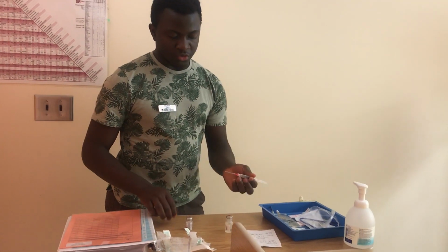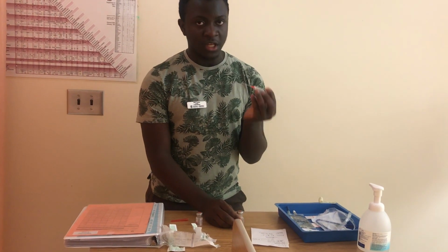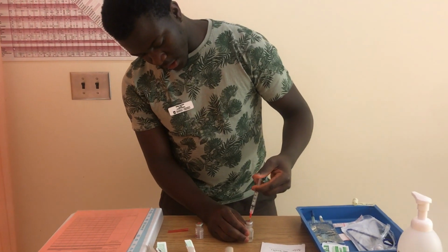Once it's dry, for the purpose of this video, I will inject my 2 milliliters of air into the vial, and then let the pressure fill. I'm going to recap. I have 2 milliliters of air.